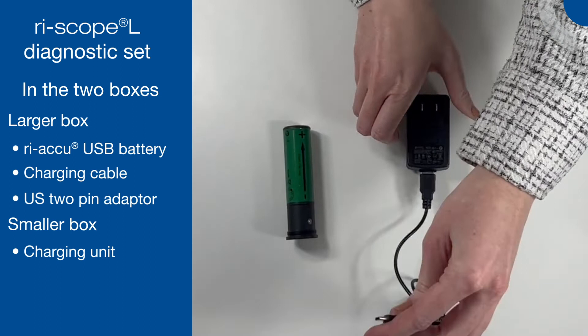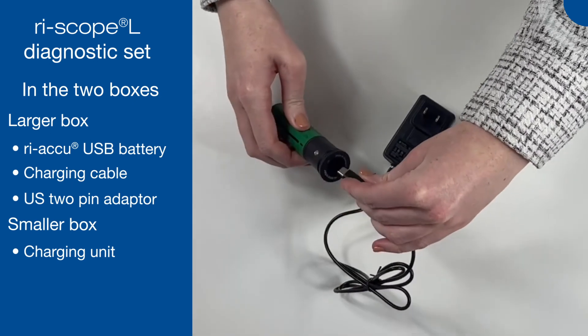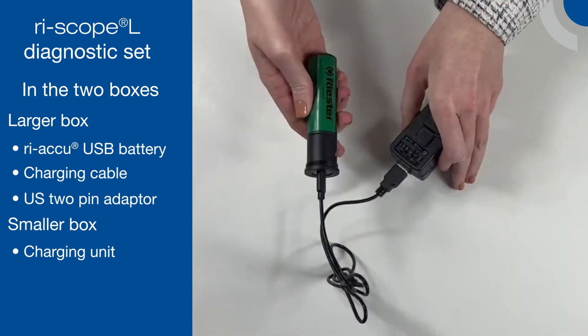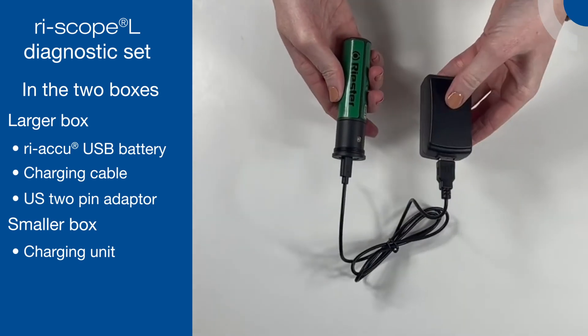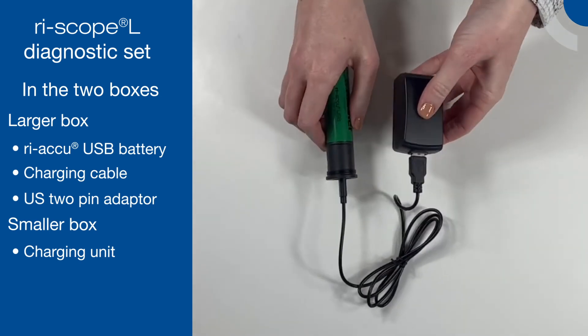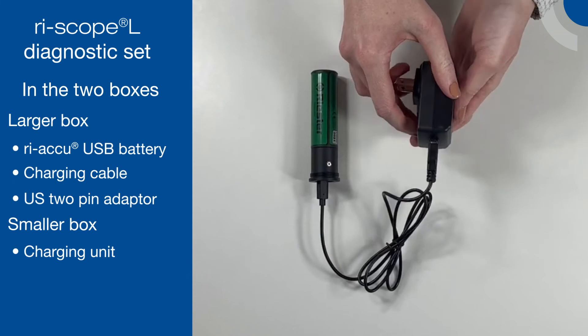Insert the charging cable into the charging unit using the USB end of the cable and insert the smaller USB-C end directly into the battery. Plug the charging unit into an electrical socket to charge the battery.